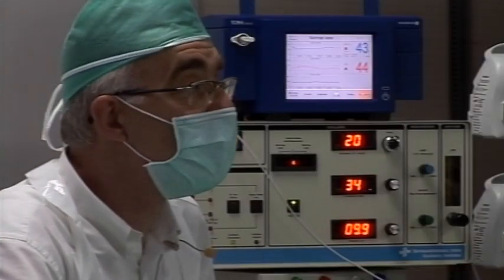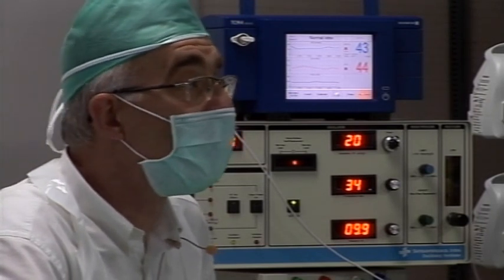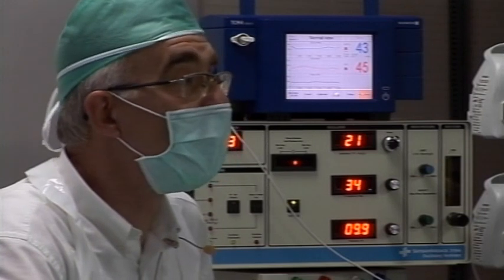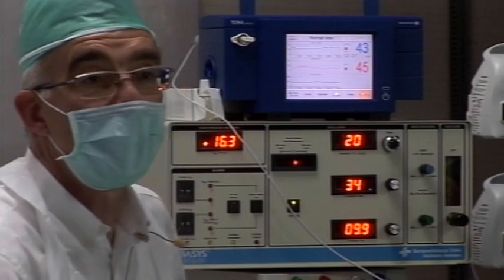3 things. Pneumothorax first. Overdistension second. You decrease your CDP by 3 to 4. And the baby getting sicker third. It's easy. All is in the book. Okay, we are at 98. It's better with that than with 17.5. So we should keep decreasing, no? Yes, sir.